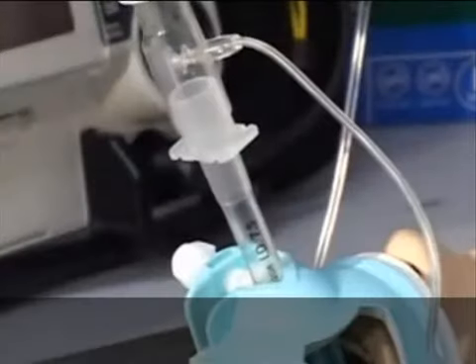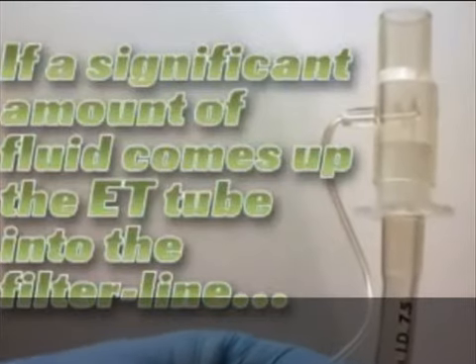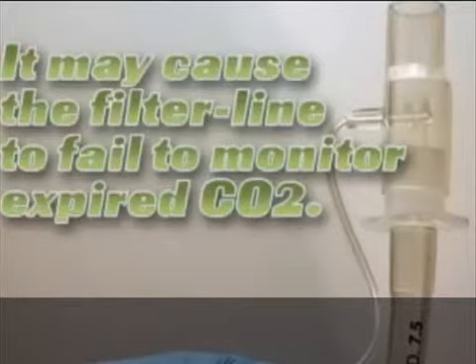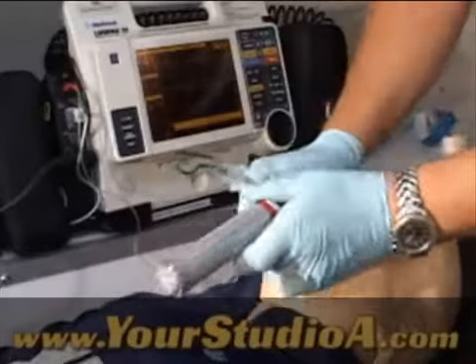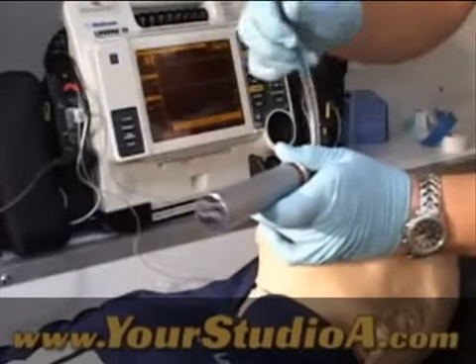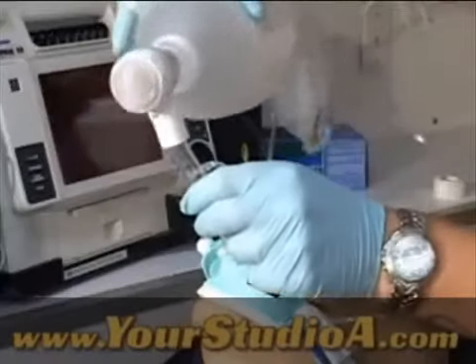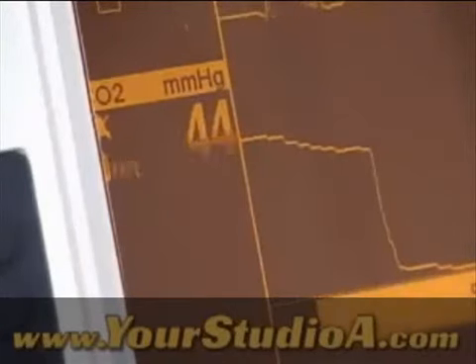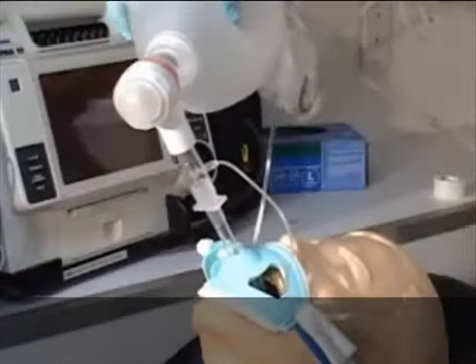When using the ET tube device, it is recommended that you have several filter lines available, because if a significant amount of fluid comes up the ET tube into your filter line, it may cause the filter line to fail and not monitor CO2. To use the end-tidal CO2 for ET tube, attach the orange filter into the LifePak 12 while intubation is being attempted. After the ET tube has been inserted, attach the filter line to the ET tube end and ventilate the patient. A quantitative measure of CO2 in the presence of a waveform on the LifePak 12 display is confirmation of correct tube placement.